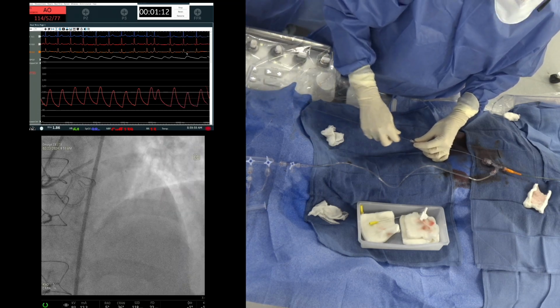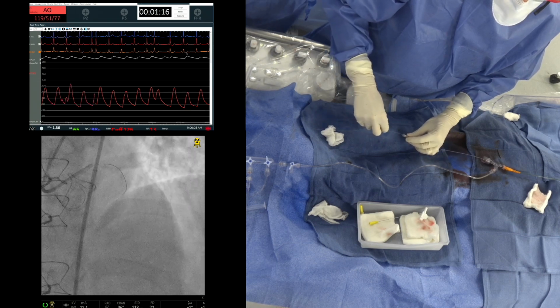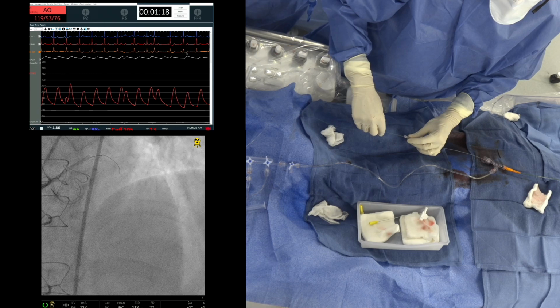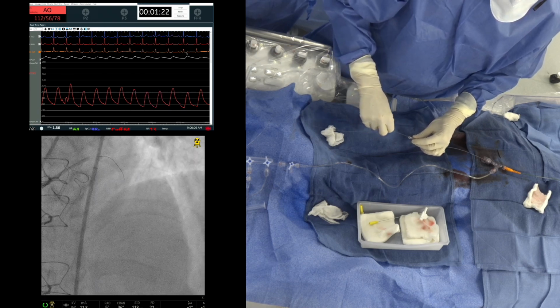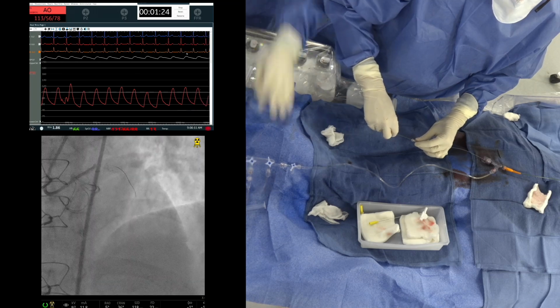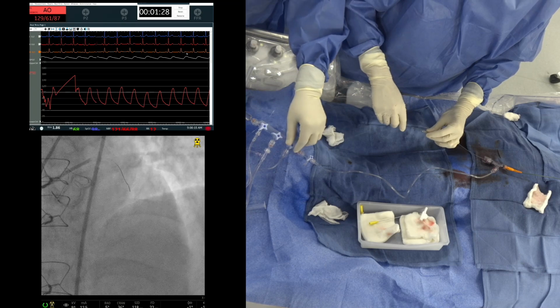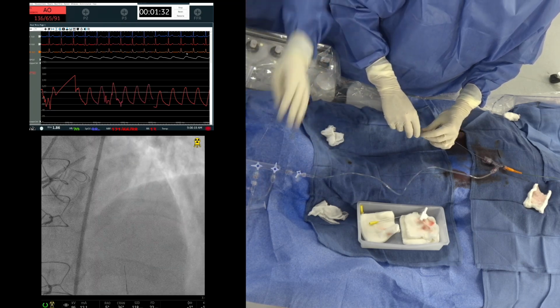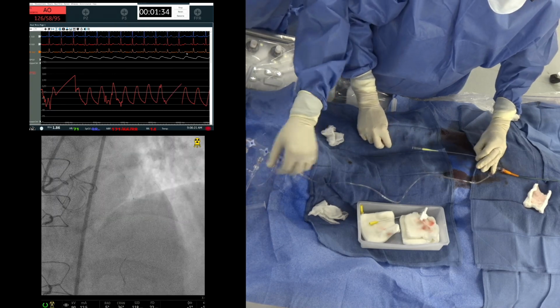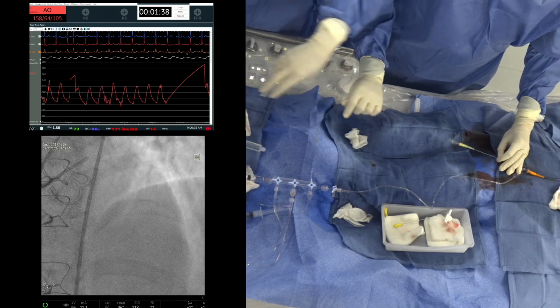Okay, so now we'll need a cutting balloon also, for the ostial circ, a 3.5. Maybe in a different way. Yeah, good. The amount of calcium may be there. See there? What do you feel about the cutting balloon versus an OPN NC balloon for the circumflex? I think one of them will be good enough, or both of them.